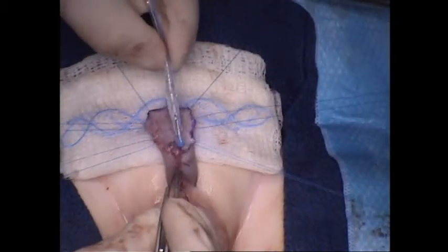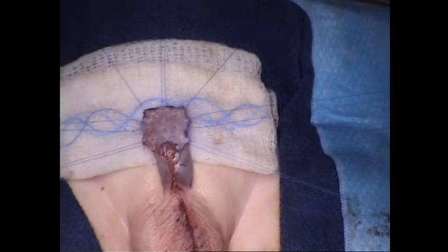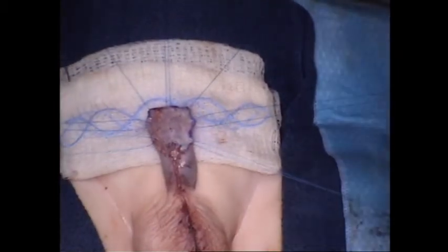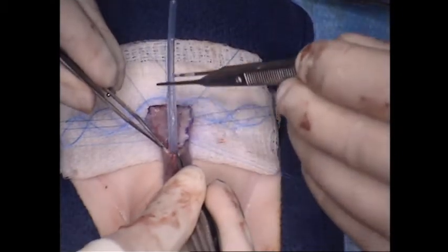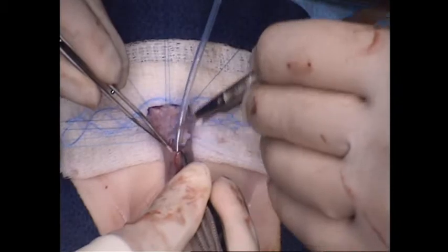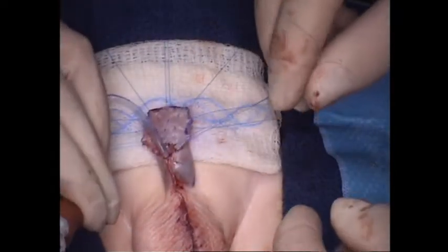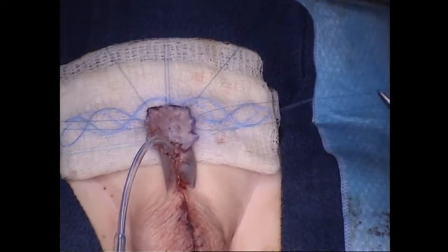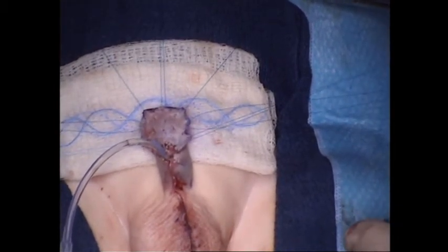Helpful if there's concern, even though it says 8 French, they often will expand it. So now she's just rolled up a piece of Vaseline and gauze.